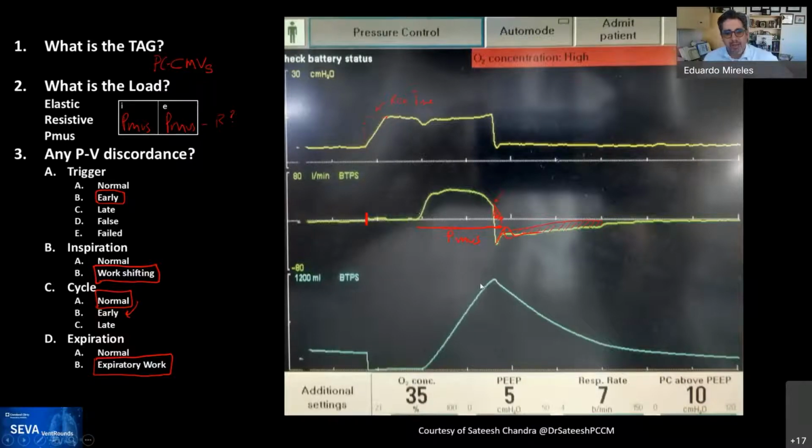I don't know. Actually, when I was looking at this and I saw the absence of change of volume here, it made me think that this patient was actively exhaling, the ventilator pressurized, and because the patient is actively exhaling, he doesn't get any breath in. So he was exhaling. He's one of those patients that take a deep breath in and then they go. But if he was exhaling, why wouldn't you see an expiratory flow?